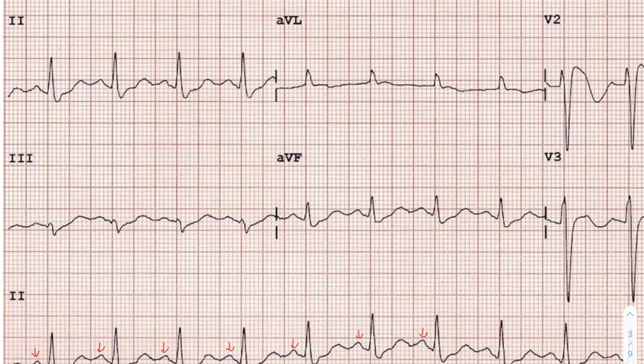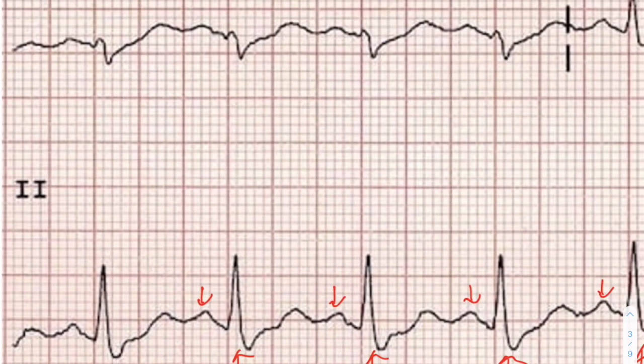Next we zone in on our QRS complexes to assess whether they are narrow or wide. Our rule is that QRS complexes must be less than 120 milliseconds, which is less than three small boxes. The QRS complex here is about two small boxes wide, which is less than three, so it is less than 120 milliseconds — a nice normal narrow QRS, which is what we expect to see.